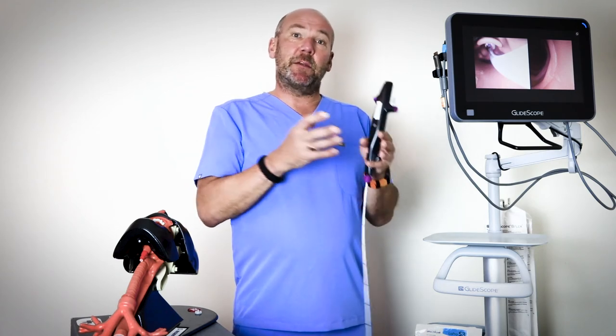In terms of double lumen tube placement, it's an all-in-one system for that as well — you can use a video laryngoscope blade to place the tube and then use the bronchoscope to check the position of the tube, without having to change over systems.